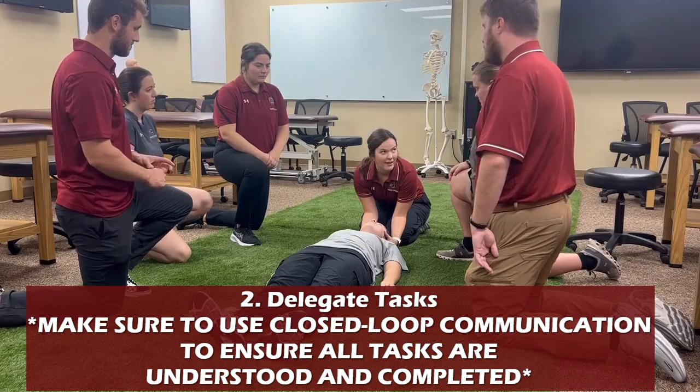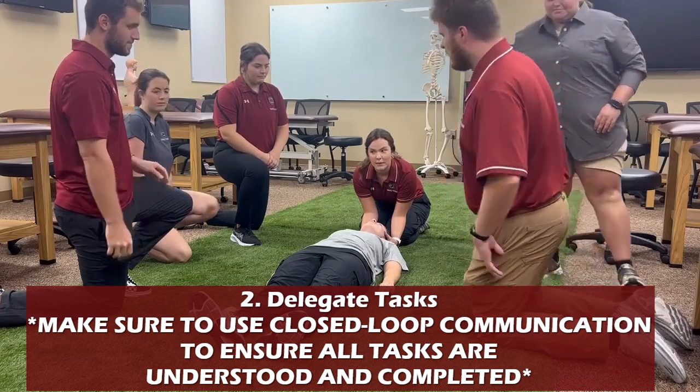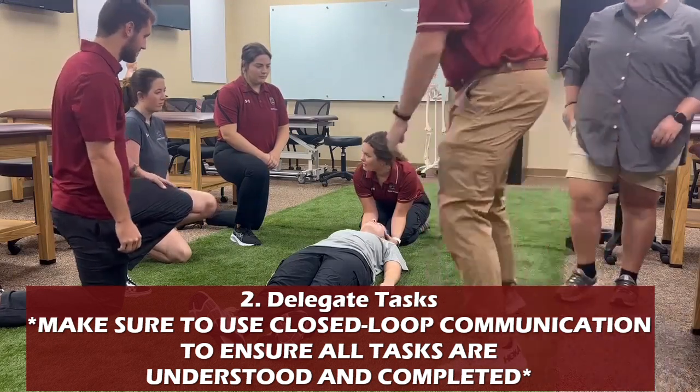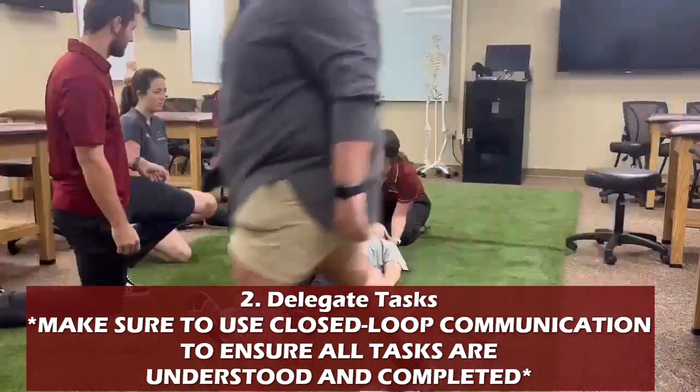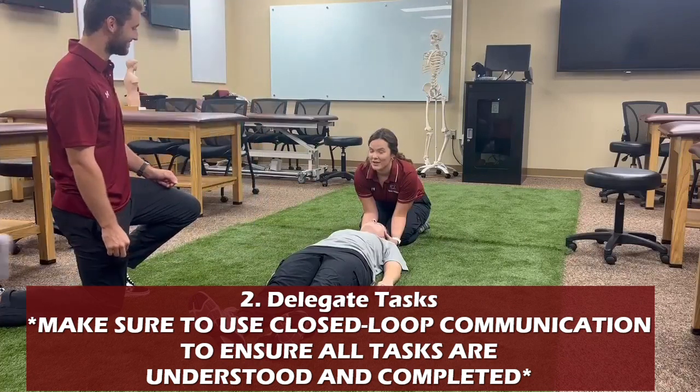So I'm going to have Allie call 911. I'll call 911. Brandon, get the emergency equipment. I'll get the emergency equipment. Sammy and Abby, grab the spine board. And we'll grab the spine board. And Brooks, do the neurological testing.